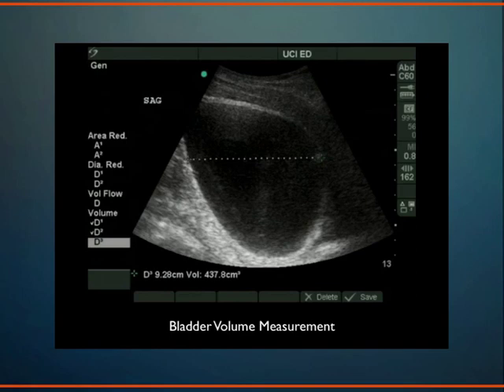So on transabdominal bladder ultrasound, we can measure the dimensions of the prostate. So measuring the prostate and having that post-void residual, whether you're in the outpatient clinic, the ER, or the ICU, is good information to have about your patient. Does that answer your question?